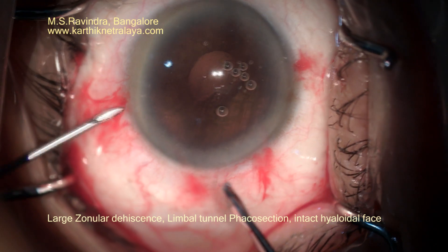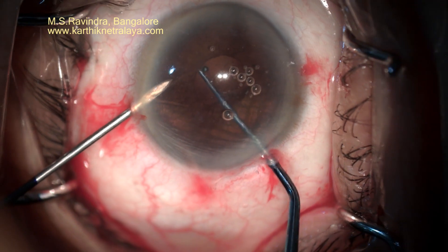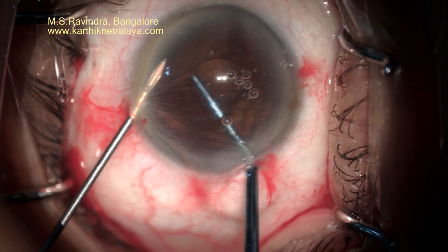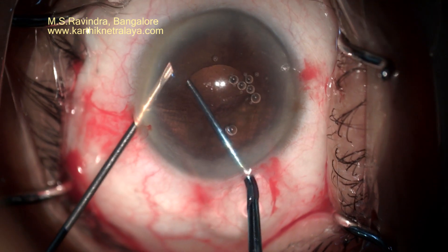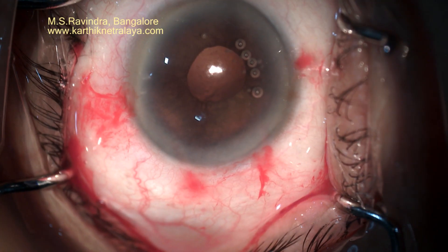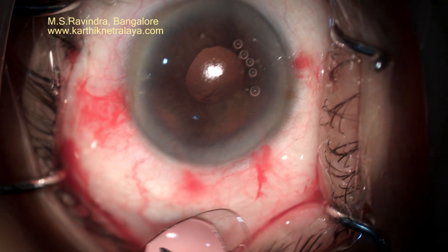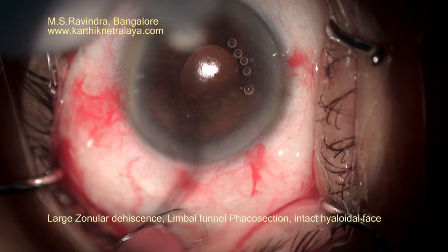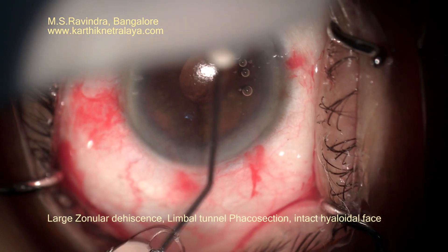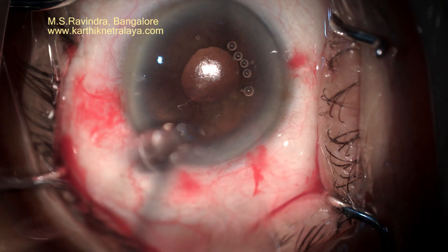A large zonula dehiscence was noted during a routine cataract surgery in a middle-aged lady. The capsular bag was ultimately removed after extraction of the nucleus and epinucleus. Cortex was aspirated completely. The hyaloid face has remained intact. It is a limbal tunnel phacosection.